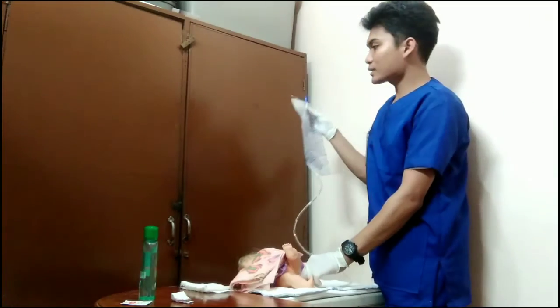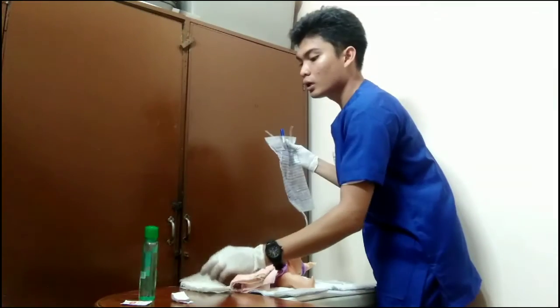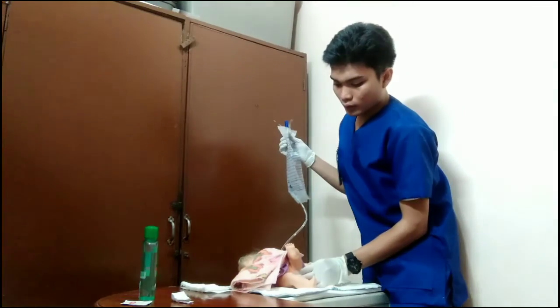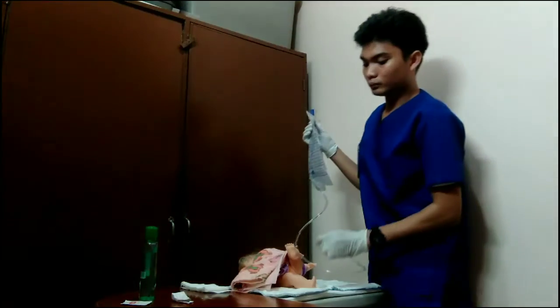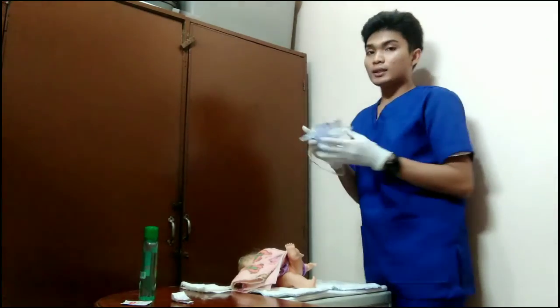Now let us say for an instance that we are already done administering the enema. We will be getting some tissue and wiping the anus of the client, and then discarding the solution and the drainage bag.